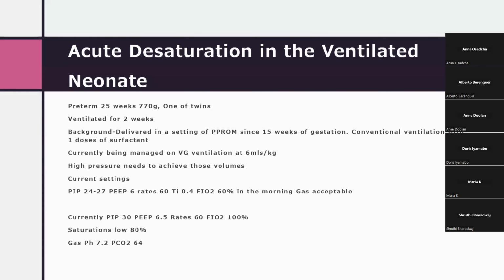And the baby's got a chest x-ray picture of, I would say, evolving lung disease. No focal pneumonia, no focal patchiness, no air trapping, no PIE, just evolving lung disease. And really, the discussion that we're having after having completed antibiotics in the first week of life is whether this baby may be heading towards steroids. Okay, so that's the background. Any questions?